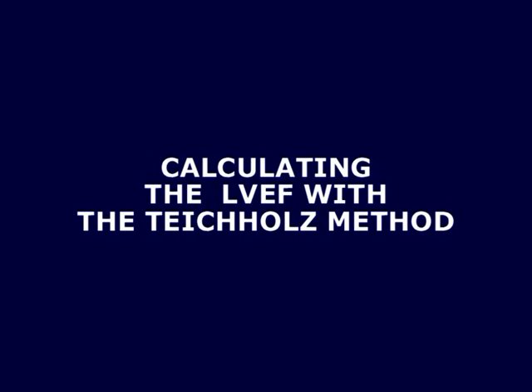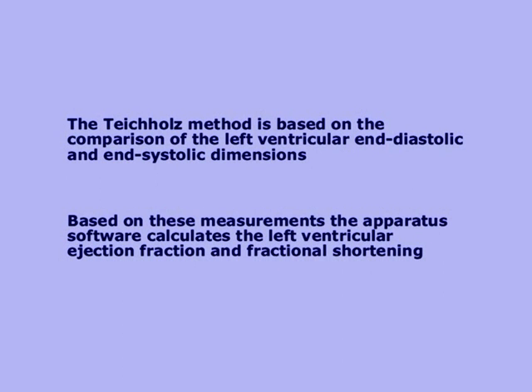Calculating the left ventricular ejection fraction with the Teicholz method. The Teicholz method is an old and widely used approach to calculate left ventricular ejection fraction. To use this method, one should obtain left ventricular M-mode measurements at the base of the heart.